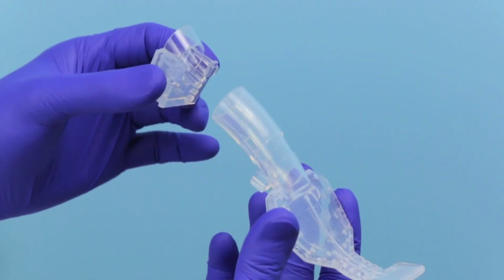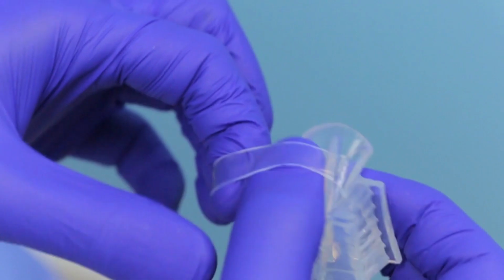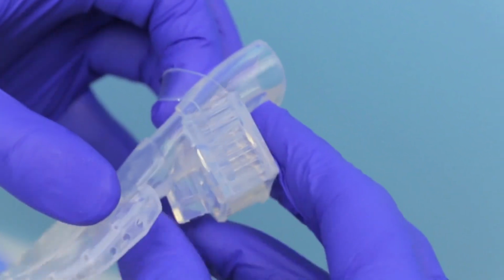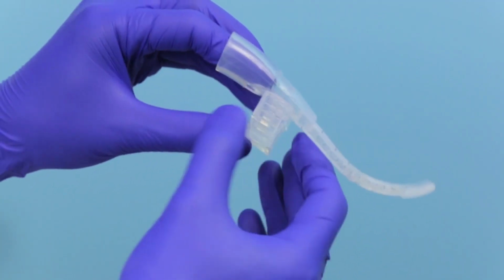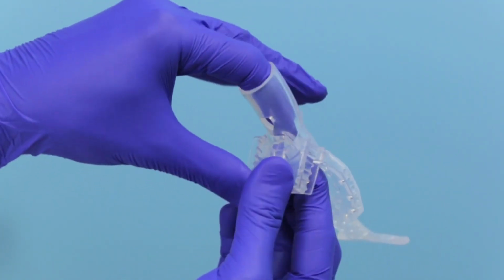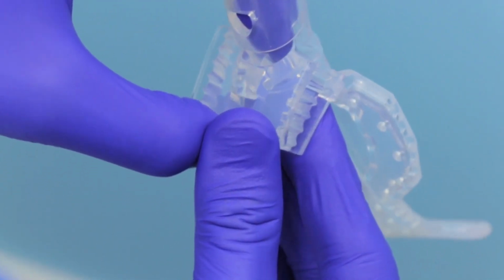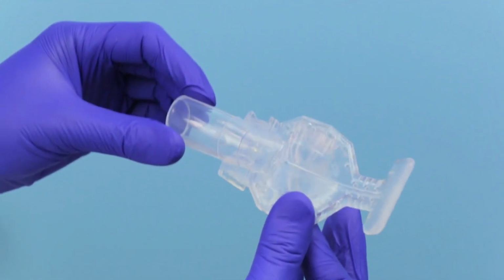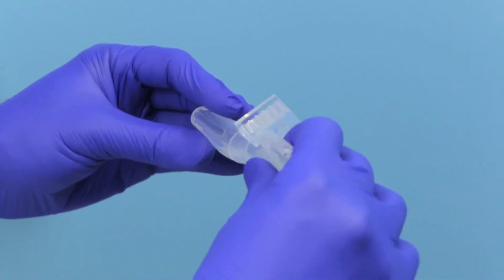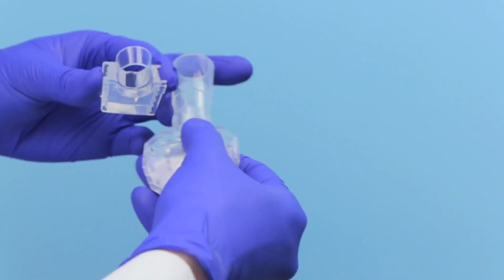To attach the bite block to the mouthpiece, squeeze the mouthpiece while simultaneously pulling the strap on the bite block over the mouthpiece. Slide the strap into the notched area on the mouthpiece and slide the bite block onto the mouthpiece. With an index finger, press the plug into the bite block undercut slot. Ensure a snug fit and that the bite block is locked into place with the strap lying flush with the mouthpiece. To detach the bite block from the mouthpiece, pull the bite block off of the mouthpiece, detach it from the plug, and gently slide the bite block strap off of the mouthpiece.